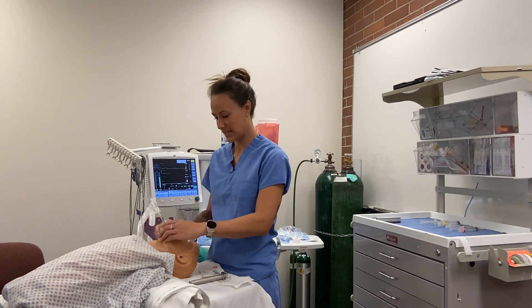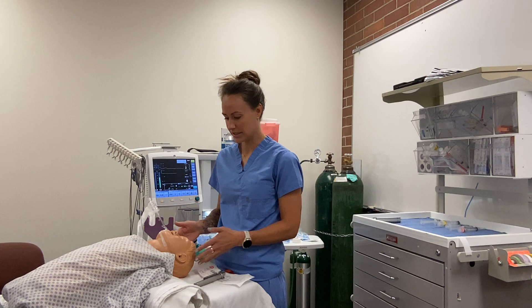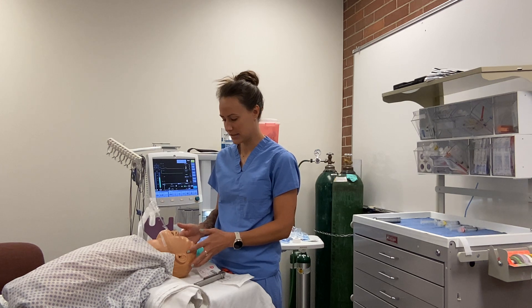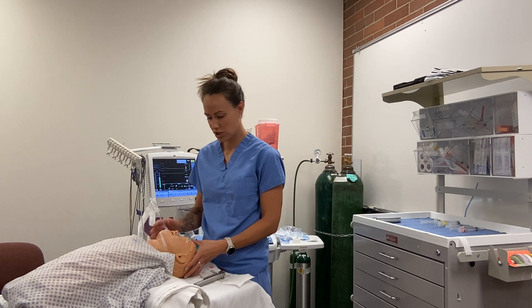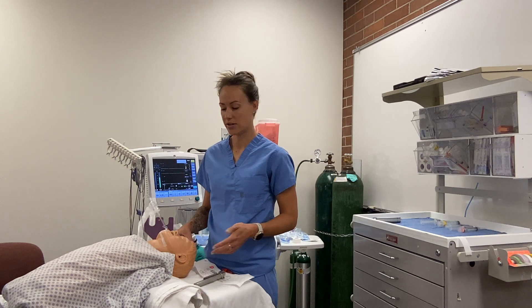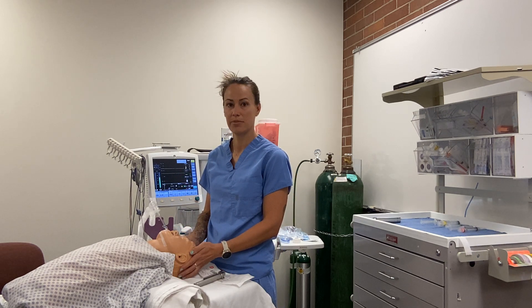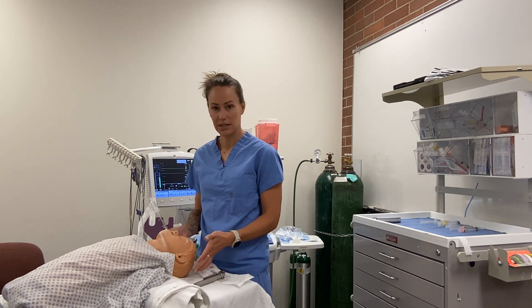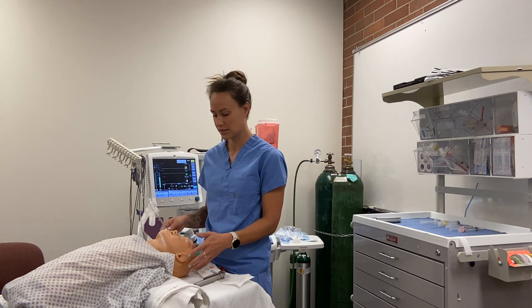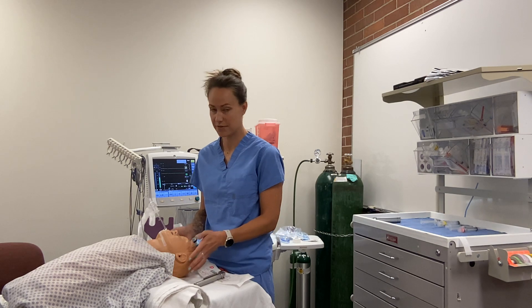Now that the tube is in, there's always a risk of bronchospasm during the case, which occurs in the lungs. You would see this by a high pressure alarm with dropping tidal volumes and loss of end-tidal CO2. First check your tube — make sure it's not kinked and is positioned correctly. Then check for cardiac involvement; if present, this is likely an anaphylactic reaction — turn off gas and give 1 mcg/kg of epi. If no cardiac involvement, try beta-2 agonists by squirting into the lungs, methylprednisolone, or an anticholinergic like ipratropium. If those don't work, give epi.